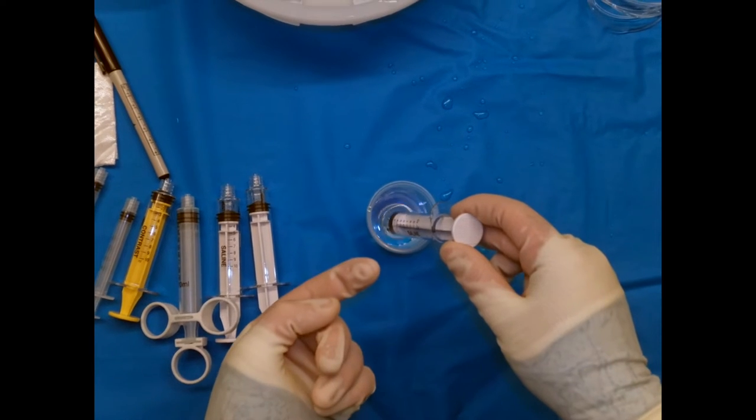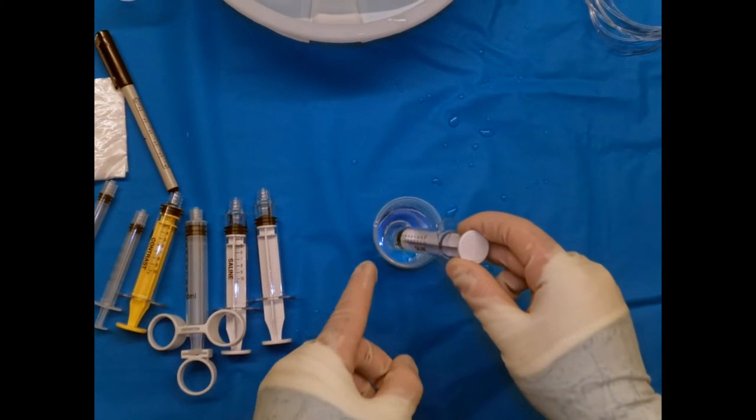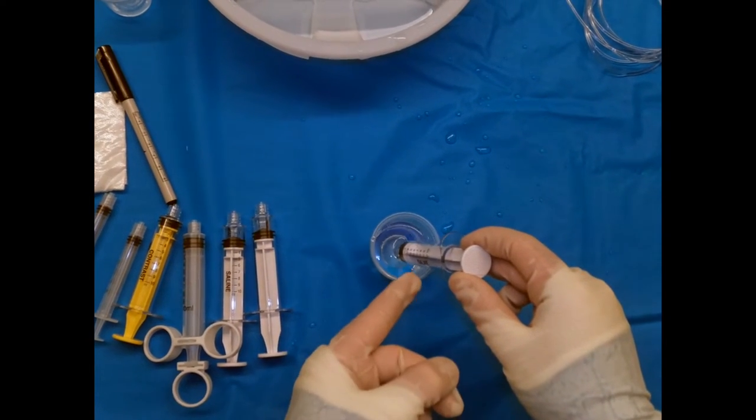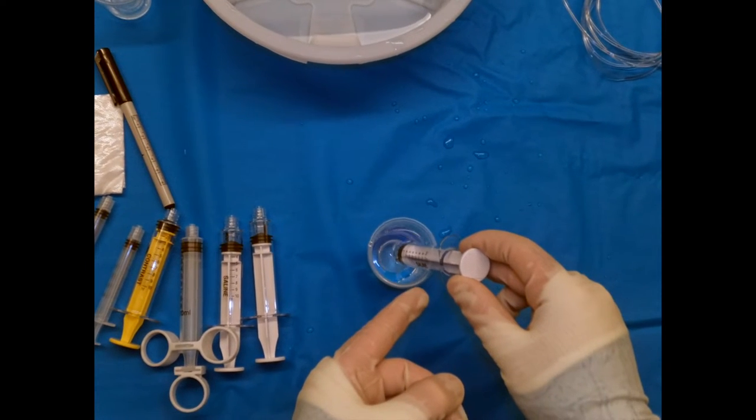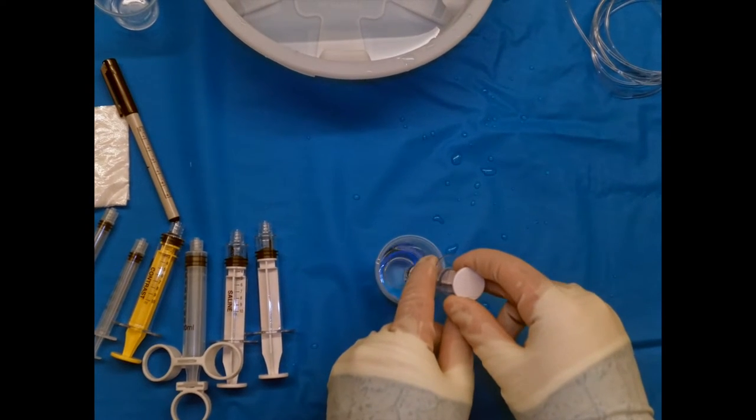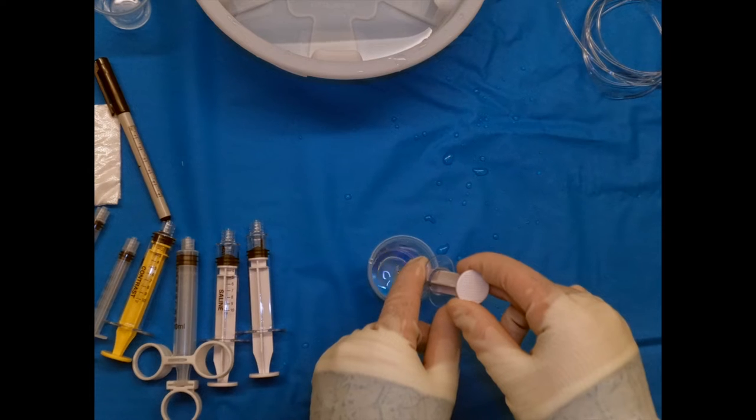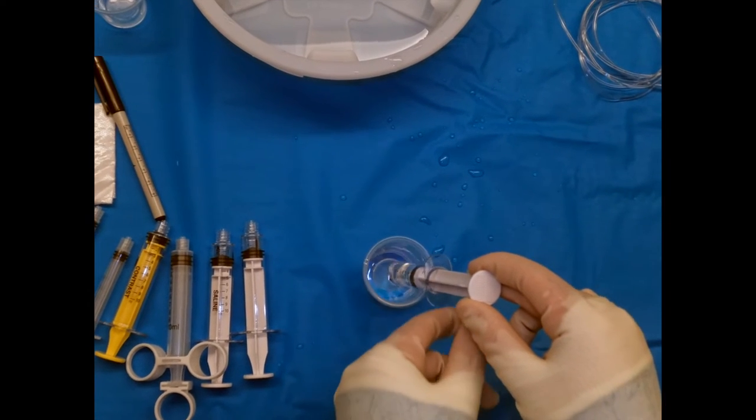You're going to keep the back of the plunger facing the ceiling so any air from the system will collect on the tip of the plunger, all in one place. So we're going to pull back, always keeping the syringe pointing up.